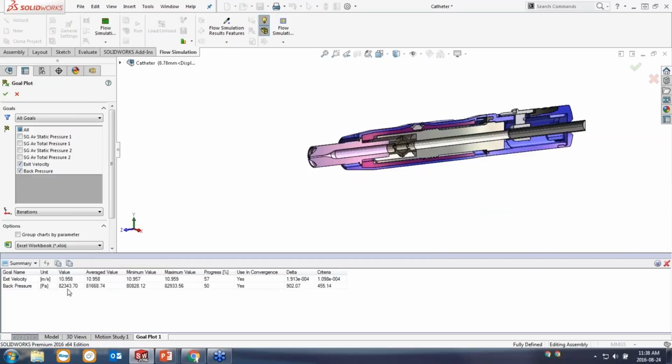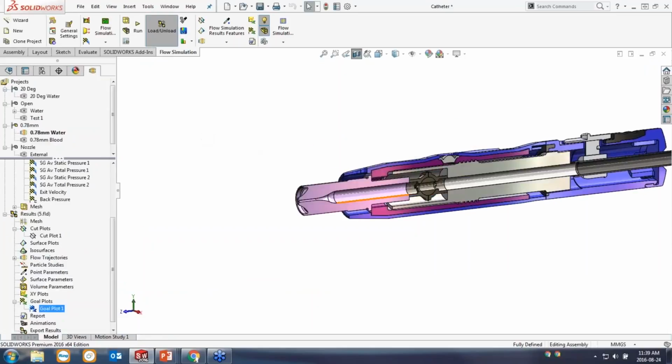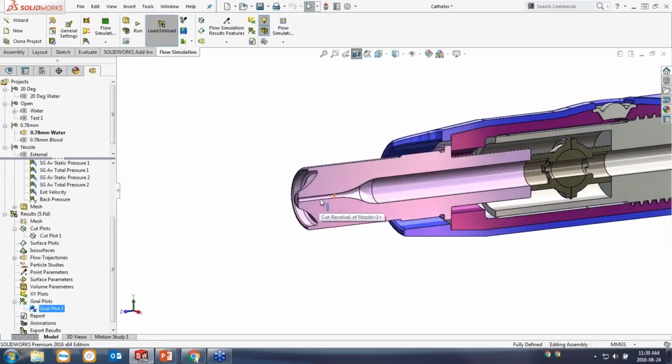The parametric study had 0.78 and some other decimals after that. I figured manufacturing to closer than just 2 decimal places on the millimeter might be a little bit unrealistic, so I rounded that off. And we can see that even minute changes in the diameter are going to have pretty good effects on that back pressure. So we might need to be cautious as to how we monitor that for manufacturing. Maybe I want to increase that even a little bit more, up to 0.8 or something like that.